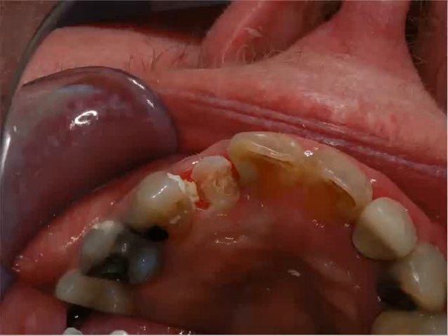We also have cases where we may want to use electrosurge. I really don't use the electrosurge as much anymore, and I'll tell you the rationale. Once I got hooked on the soft tissue diode laser, which is really an easy instrument to use. They're inexpensive now. You can get them under $2,500. They really allow you things you can do that you couldn't do with the electrosurge.